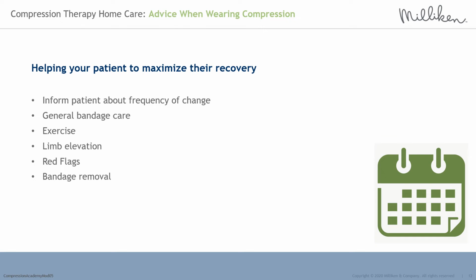The patient should not remove their own compression bandages between clinical visits, as this will delay their healing. This is unless a red flag alert is identified, which we'll explore shortly. Compression stockings, garments, devices can be removed to perform hygiene and skincare, but they must be replaced immediately.